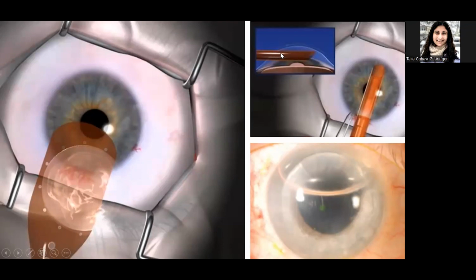So with that tube, we go into the inside of the eye, into the anterior segment, and then we inject that tissue, and that tissue opens up into the inside of the eye and lays itself over the iris. Once that's open, sometimes we have to do some maneuvers within the surgery to let that tissue open. And then after that, we inject a gas bubble under it, and then it will push it into the patient's cornea.